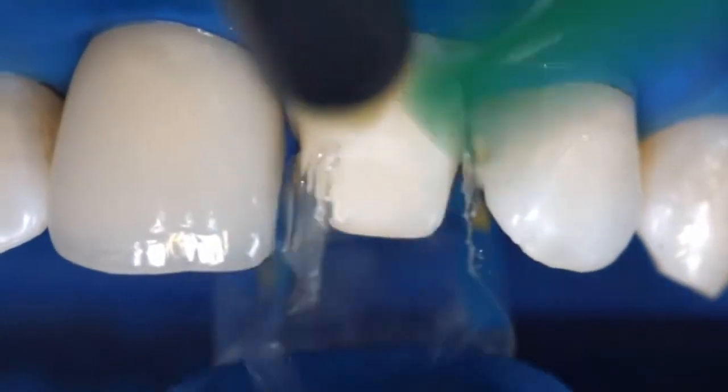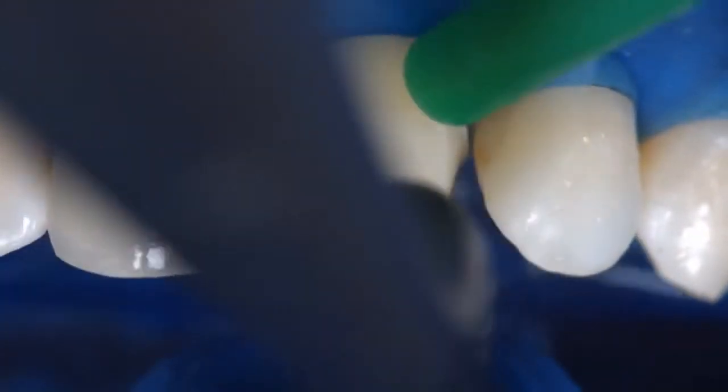Thoroughly rinse off the gel with a vigorous stream of water and air-dry the preparation until the enamel surfaces appear chalky white.